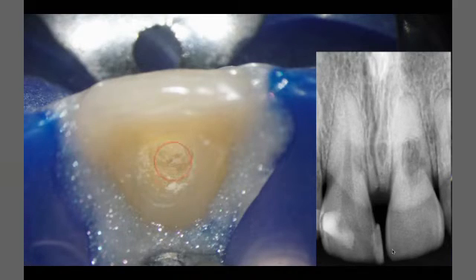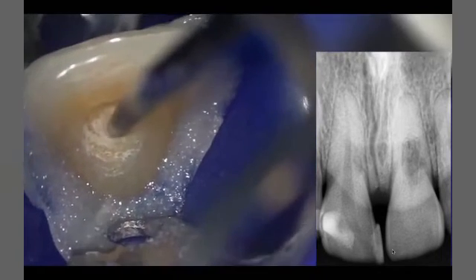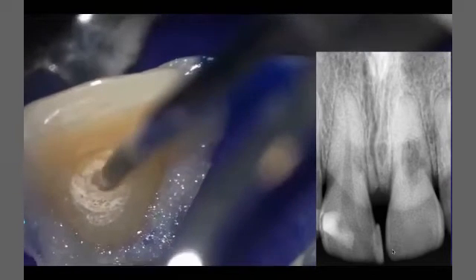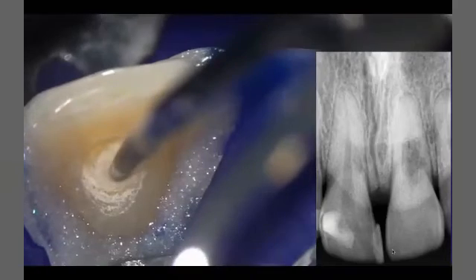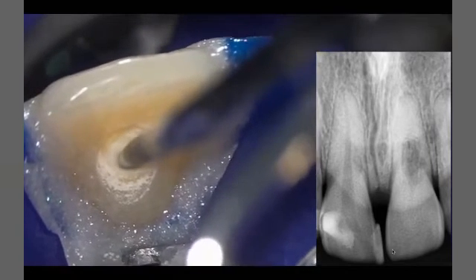And we have to follow the dark spot with our magnification and our ultrasonic tips. You can see here the dark area. So go with your ultrasonic tips. Try to stay as much as you can with the long axis of the root, troughing with the diamond tips, and as usual, irrigate, then dry again, dry as much as you can, and you will see the ring calcification, as you can see here.